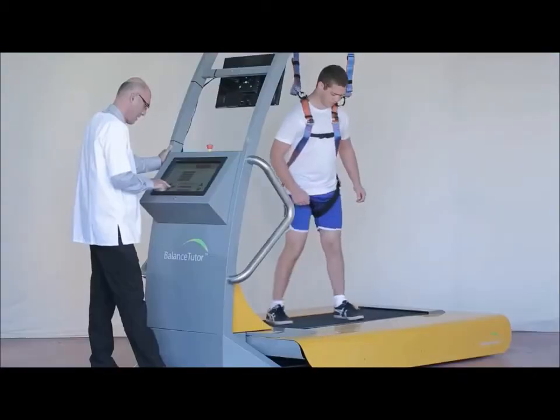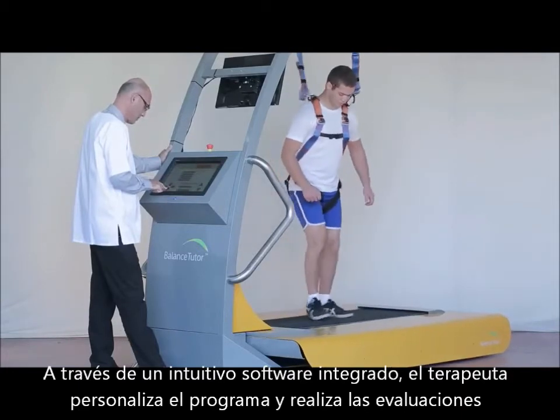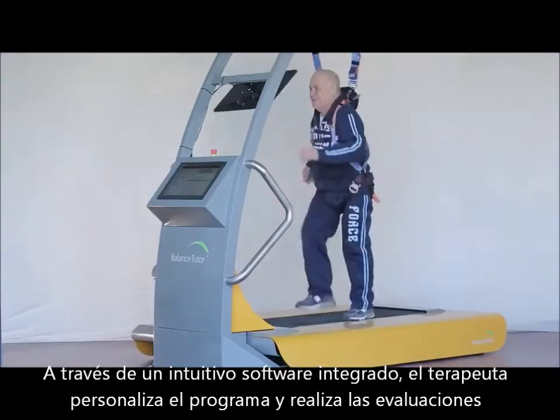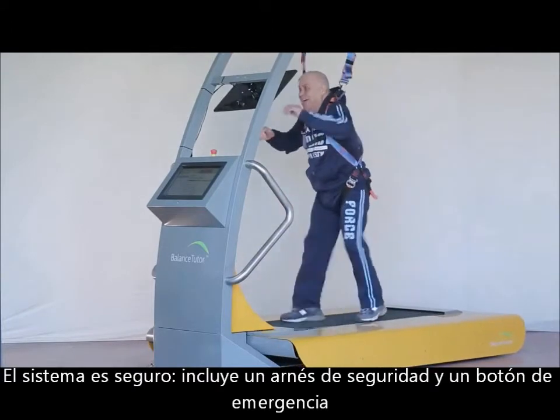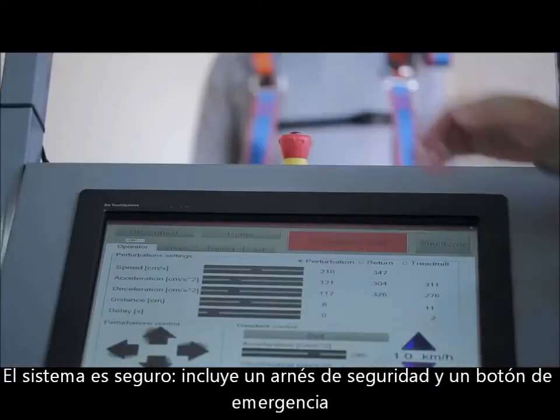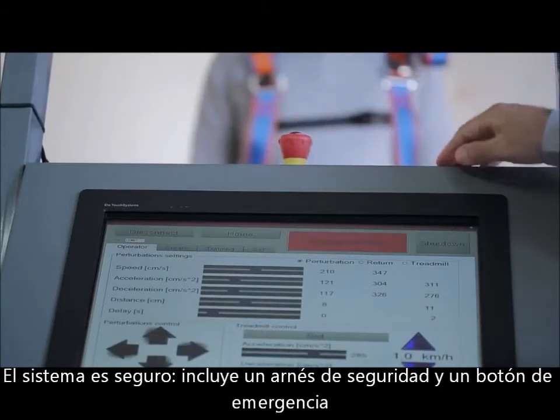The therapist customizes the training program and performs evaluations through integrated user-friendly software. The system is safe, as a safety harness and an emergency stop button are included in the Balance Tutor.